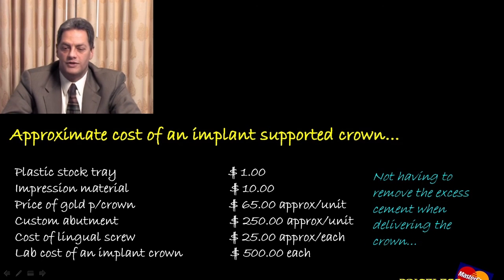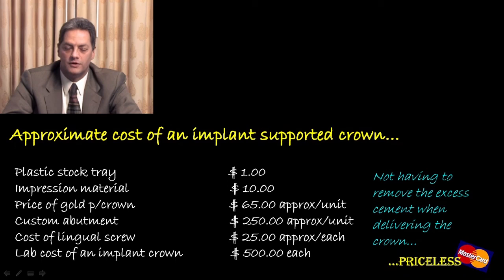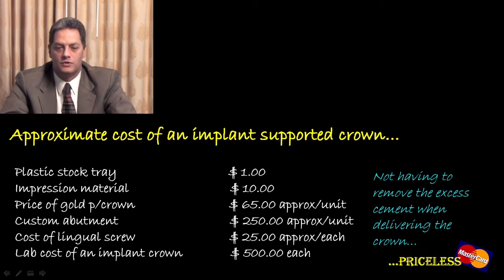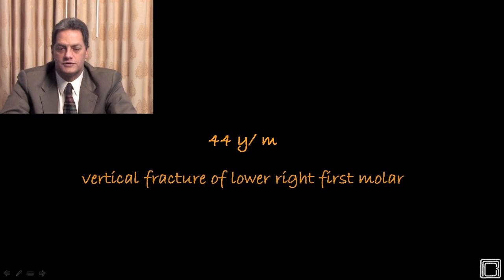Not having to remove the excess of cement when delivering the crown is actually priceless. In most of the cases, I like to have screw retained restorations.